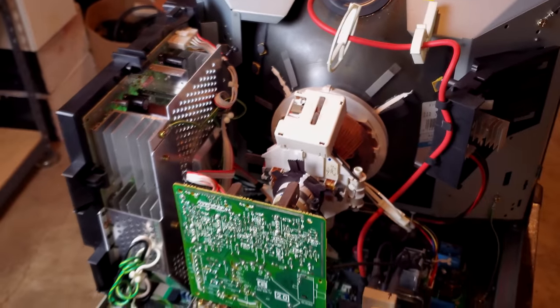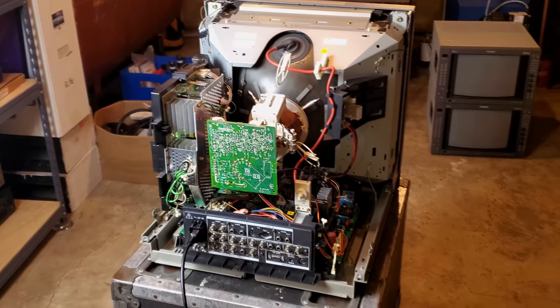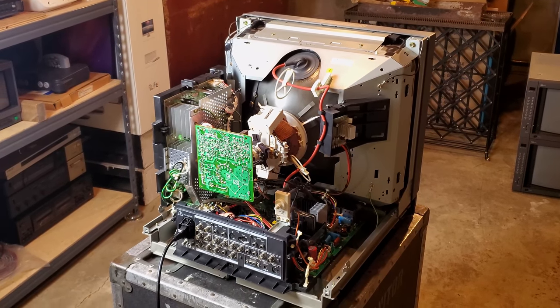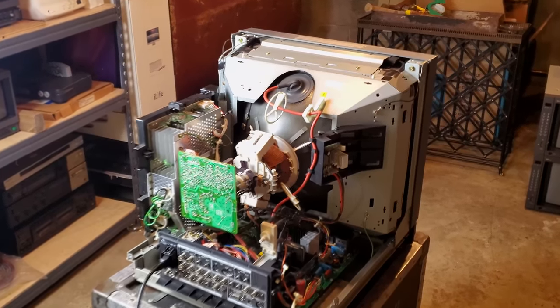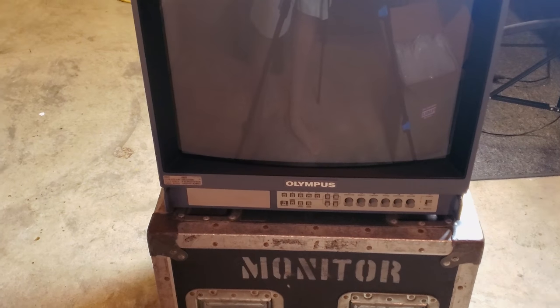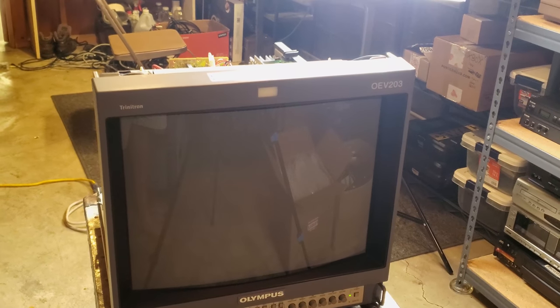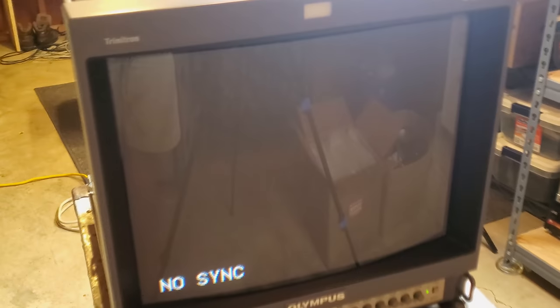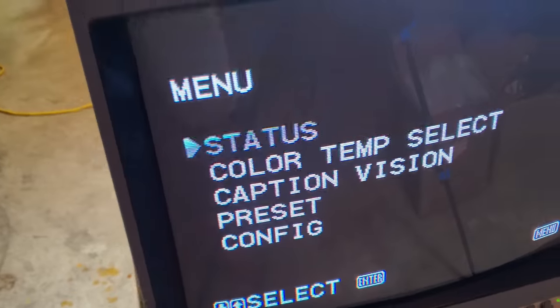We're about ready to fire this thing up for the very first time on a brand new test to see if our red, green, and blue lines have disappeared. The last time we had powered it on, we did have those red, green, and blue lines on the screen at the top due to the vertical blanking caps failing. So now let's just turn around the CRT and give it a power on and see. We got a good green stable light there — no problems here. And just like that, check it out — before you could see those red, green, and blue lines; we have no lines now. Let me push the menu button one more time. Yep, and it's gone. That's perfect.